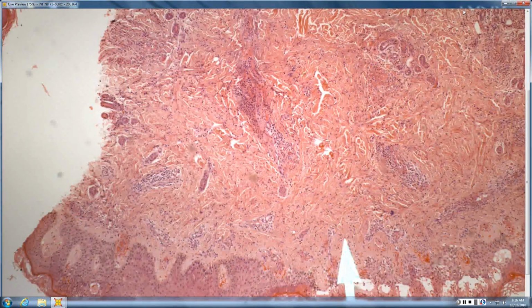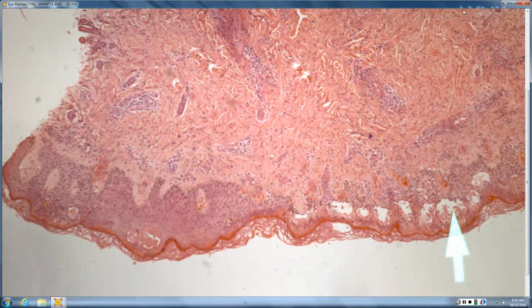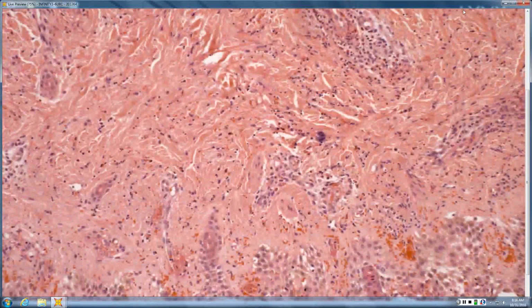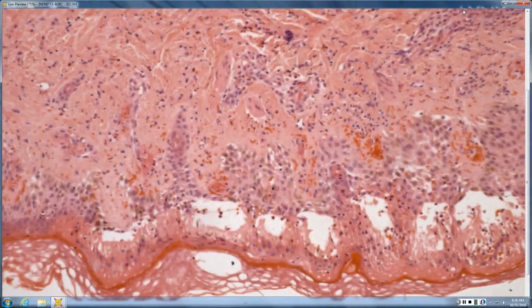I'm seeing a lot of papillary dermal edema again, it looks like. So is it papillary dermal edema or is it epidermal necrosis? Oh, it looks like epidermal necrosis. So it's epidermal necrosis, but not papillary dermal edema. And that makes it more likely that it'll be a bug bite, a tinea, something other than true vasculitis when you have the epithelial change.